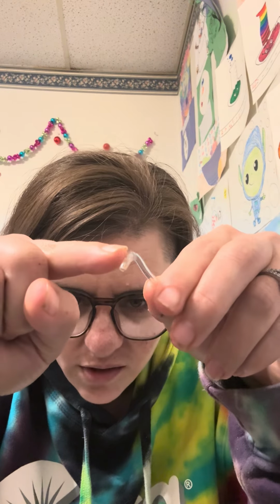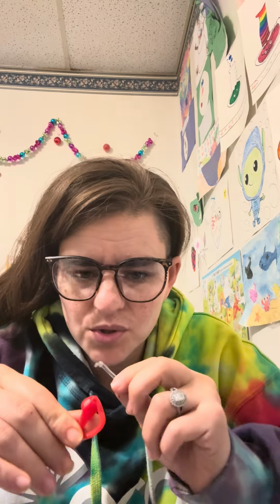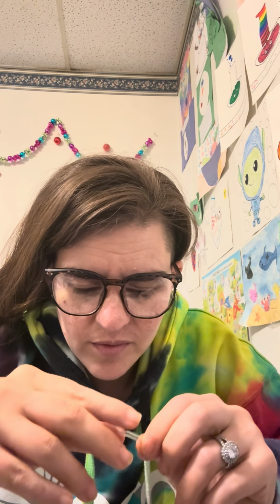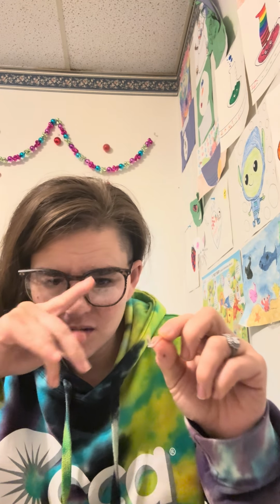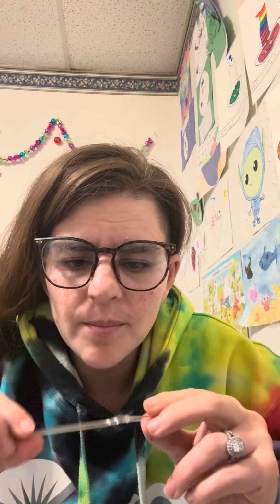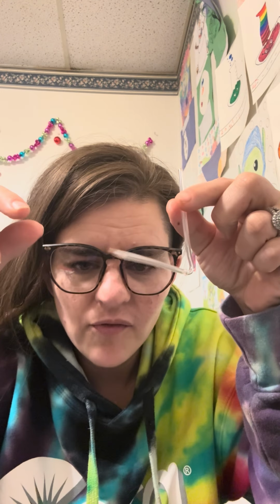Sometimes you need to use the cleaning tool to get this lock, if you have it, out of the mold, because sometimes it does get stuck, and you can just push the metal portion of your cleaning tool through that hole, which you should have gotten from your audiologist. Now, this is hard now. It's really rock hard, so this is going to be discarded, and I do this on a table in case this lock does fling. So I use number 13 locking straight tubing from Microsonic.